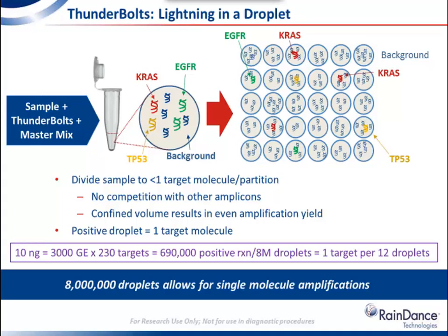In addition, because our droplets have a very uniform, very small volume, the amount of each reagent inside the droplet is also very uniform and limited. This results in PCR amplification in droplets plateauing at approximately the same level in each droplet. So both of these advantages of amplification in droplets result in a very uniform number of amplicon molecules generated in all the target regions.